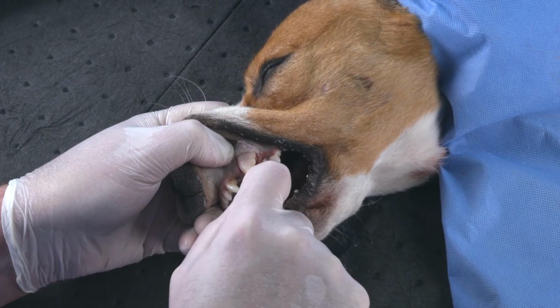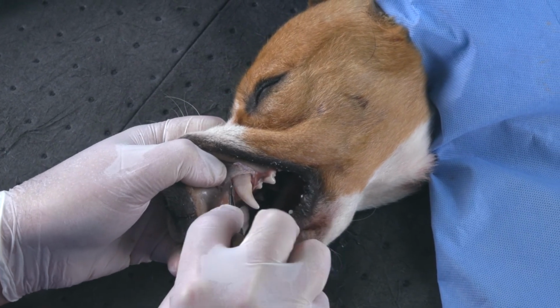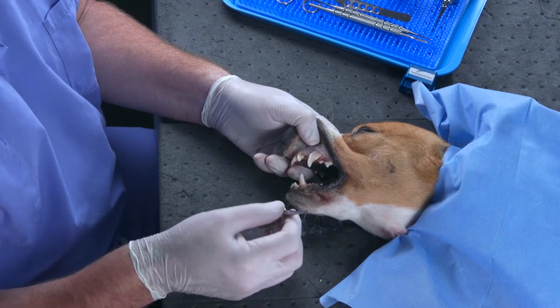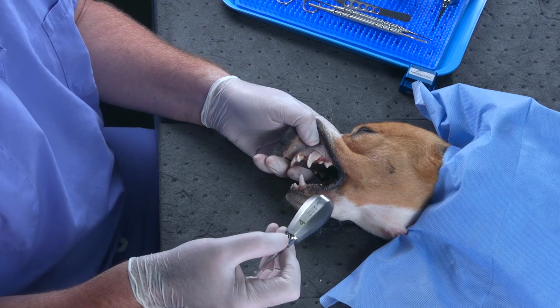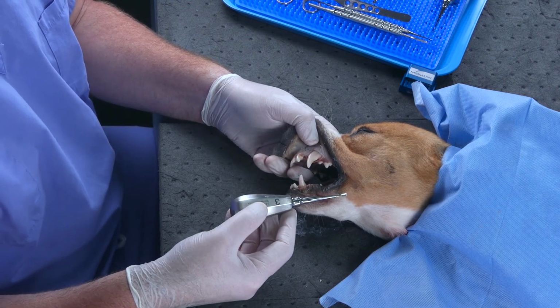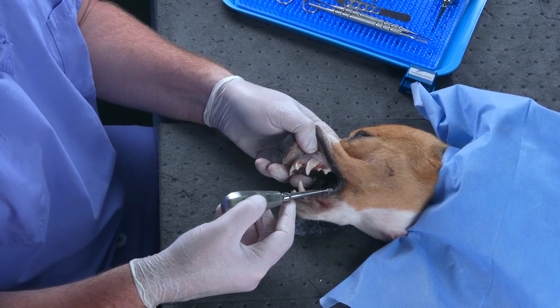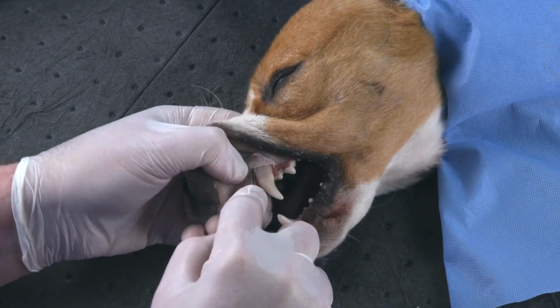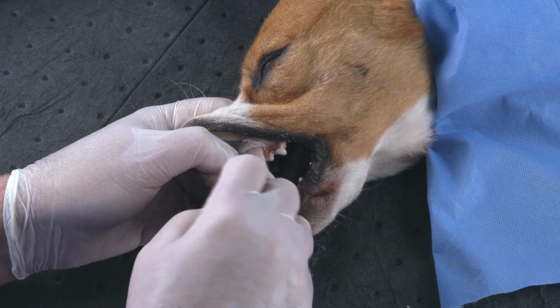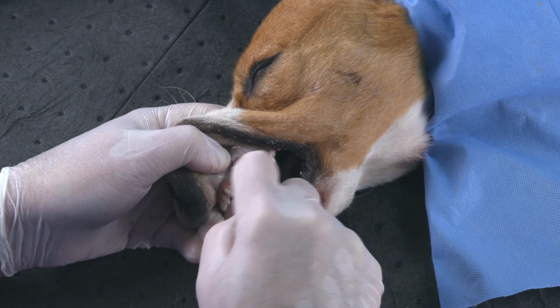Continuing the drive toward the apex of the tooth, going around the entire circumference of this tooth and waiting until the root gets looser and looser and looser. One of the things that may be necessary as we get toward the apex of the tooth is to switch size from the bigger number 4 to the smaller number 3. With the smaller number 3, I can get deeper down in between the root and the bone toward the apex, helping me to further sever periodontal ligament fibers to further loosen this root. Doing this on the mesial aspect of the tooth, also doing this on the distal aspect of the tooth as well.